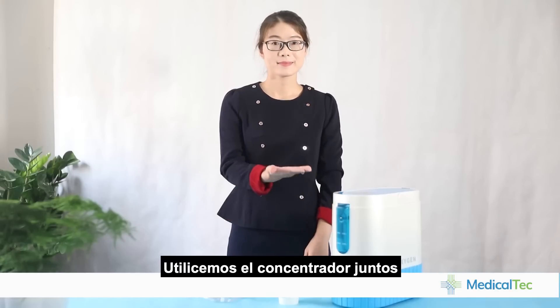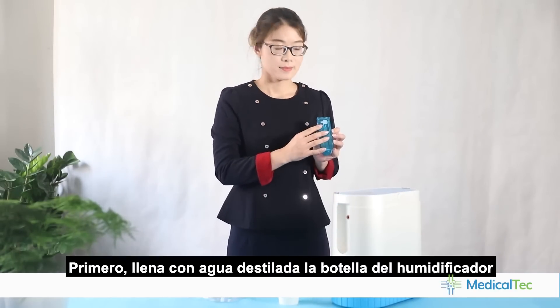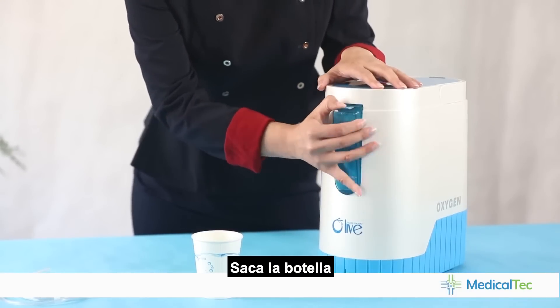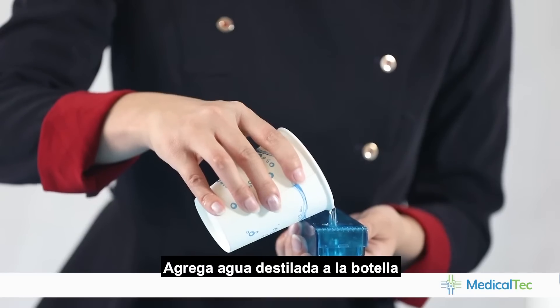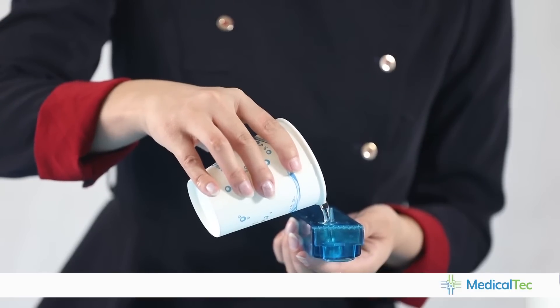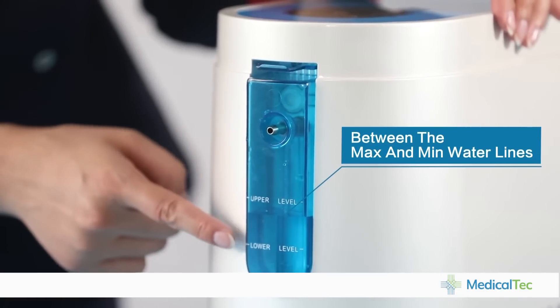Let's use the machine together now. First, fill water into the humidifier bottle. Take off the bottle, open the silicone cover, and add a proper amount of pure water. The water level shall be between the maximum and minimum water lines.